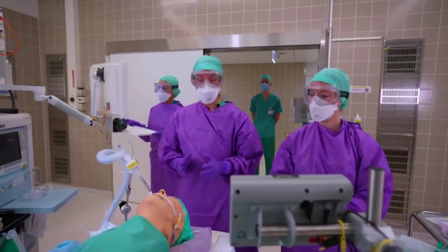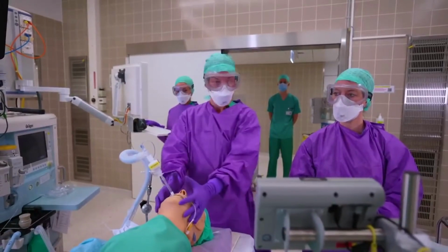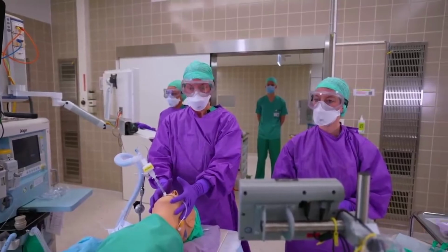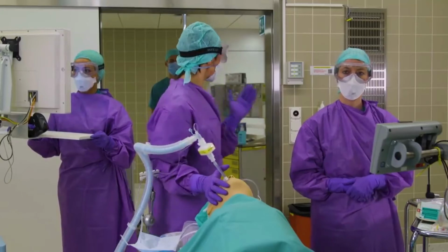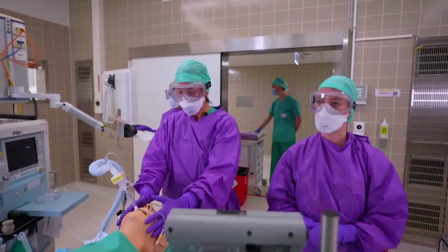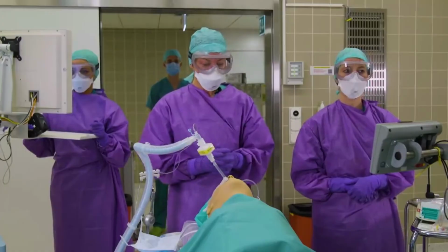If a patient is desaturating and you have to bagmask the patient, it is very important to use both hands to have a tight seal, and have a second person, Larissa in this case, to bag your patient. If the bagmasking is not successful, it is important to then reach out to the person outside the room and gather other aids, for example, LMA. If you have to escalate to a fiber optic scope, please use a single-use fiber scope.